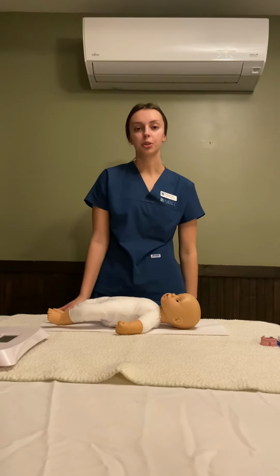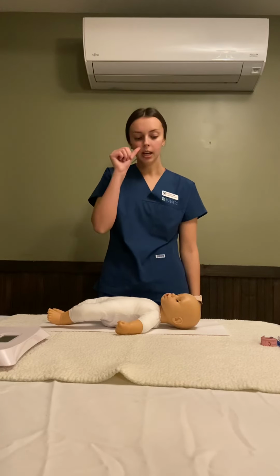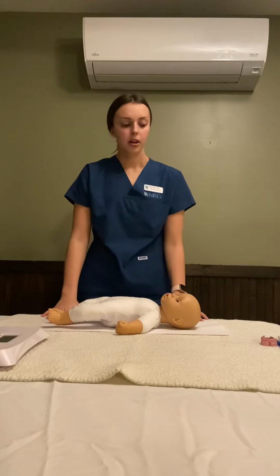It's because of all the excess fluid, but they should regain that weight within 2 weeks. And you should weigh the baby at the same time daily. Next, I'm going to measure the baby. So they're already lying on a piece of paper.